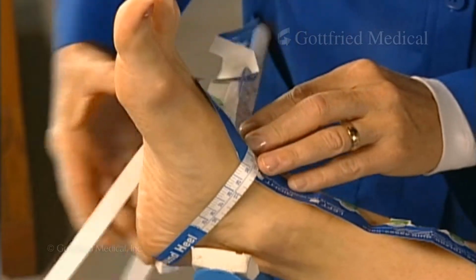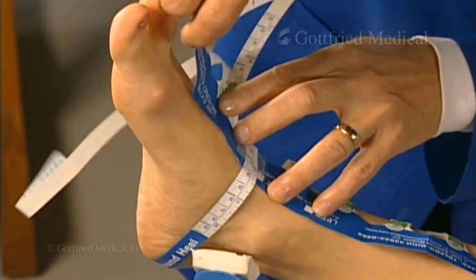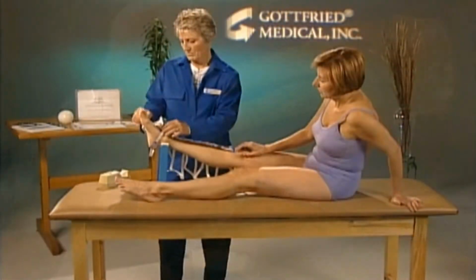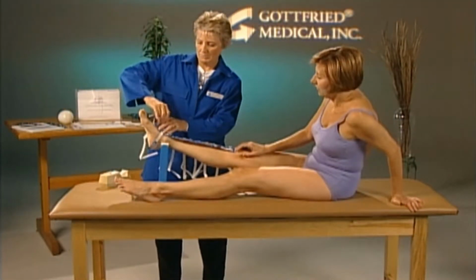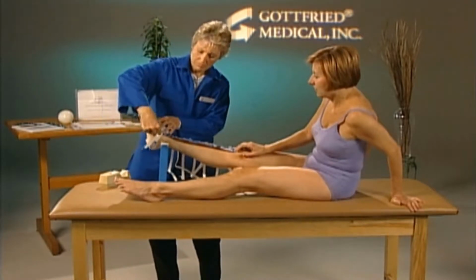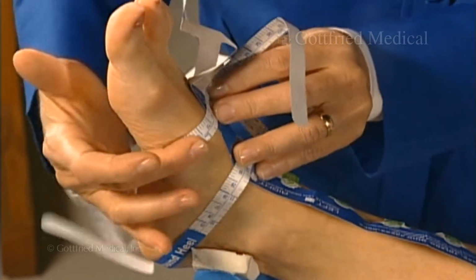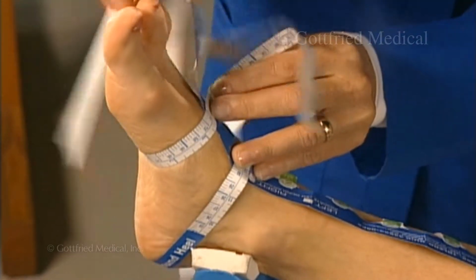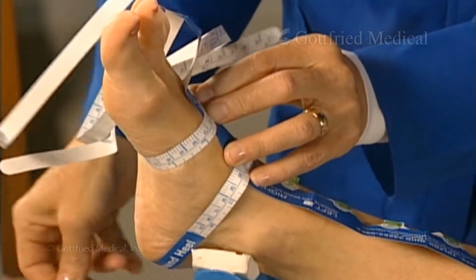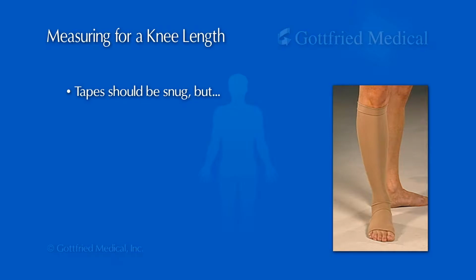The placement of this first strap is critical to the placement of all other straps and ultimately to a correctly engineered support. Working toward the toes, continue to wrap the rest of the straps around the foot. Before securing each strap to the spine, run your finger around the foot to take up any slack. The straps should be perpendicular to the spine of the tape and parallel to each other. They should be snug, not loose on the skin, nor so tight as to cause the skin to bulge.